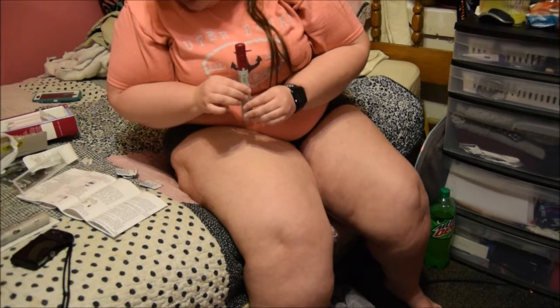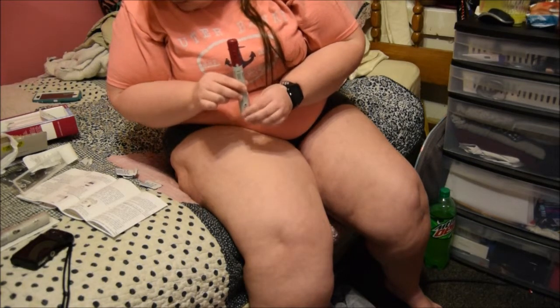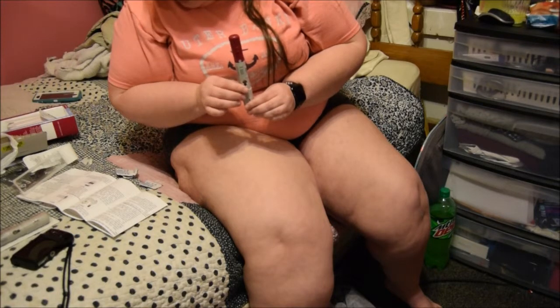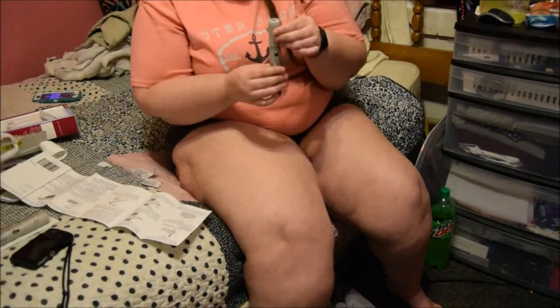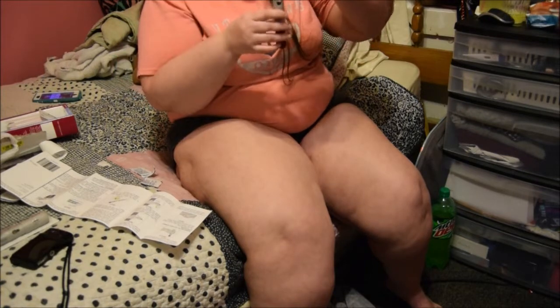Turn the pen over and hold the gray cap pointed down. Okay. Check to see through the window on the side of the pen to make sure the liquid is clear and colorless. So I hold it this way, right? And then I take the top off for this one first.